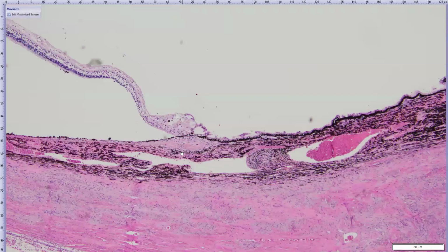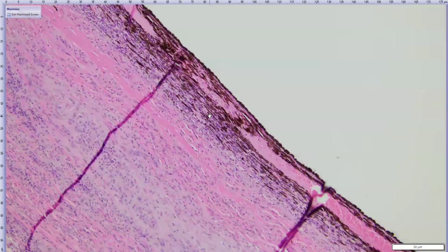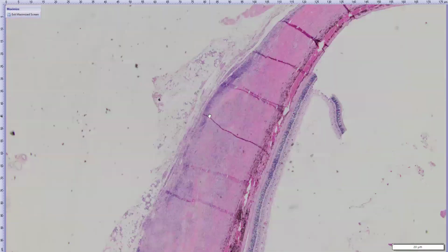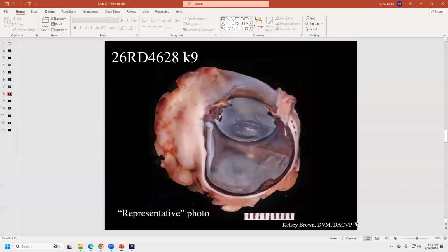In the uveal tract, we do have areas where similarly we have this kind of atypical devitalized collagen, mixed inflammation. In our choroid too, that inflammation seems to kind of dip into the stroma here and there, but does not seem to be a primary uveocentric process. This is mostly focused on the sclera. So I'm actually going to go straight to our diagnoses.